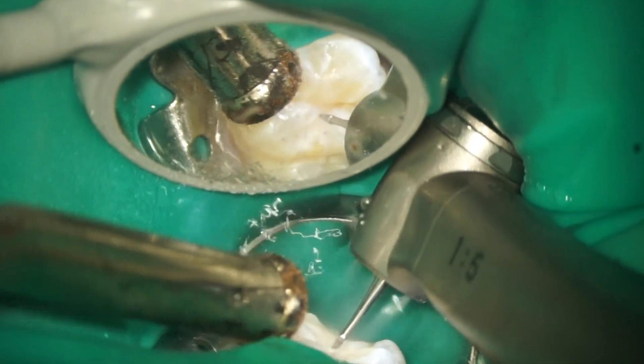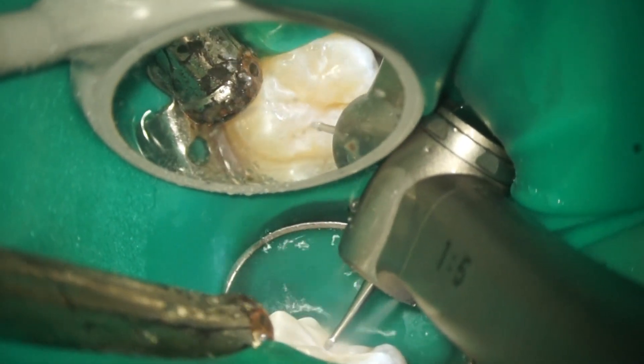In treating the maxillary molar, indirect vision is essential for clear sight and ergonomics.